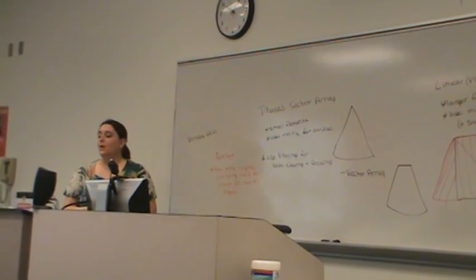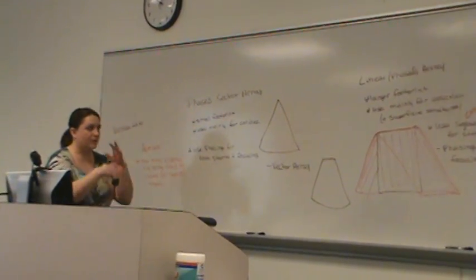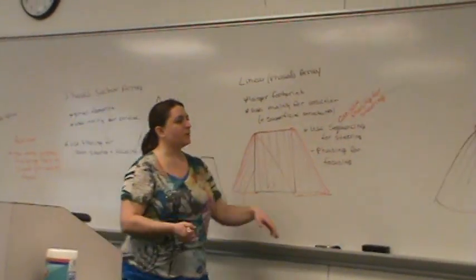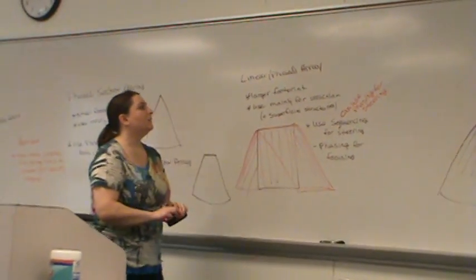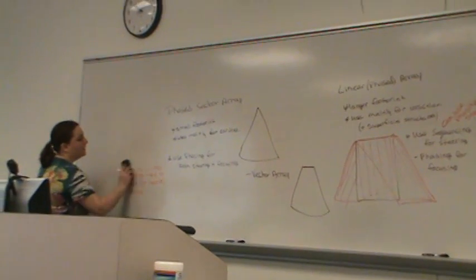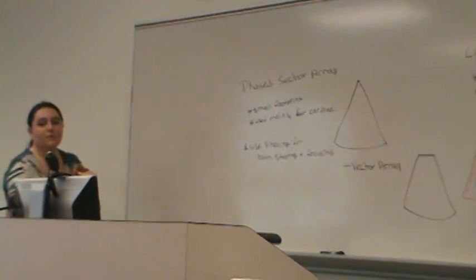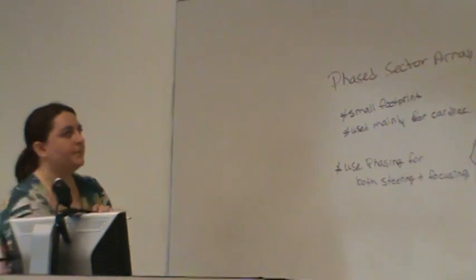Okay. Did you have a question? Oh, no. One last thing before we move off this idea of transducers and all of the different dimensions of the beam. Remember we had all those different dimensions: elevation dimension, lateral dimension, and axial dimension. And we have resolution in all those different dimensions. Remember we have all the different words that they use for those.